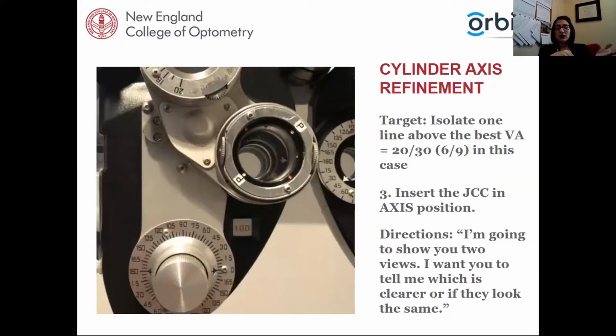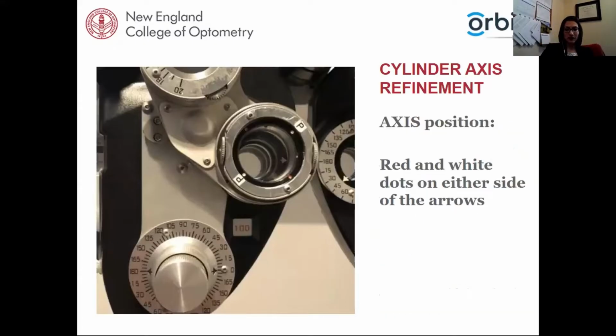You would then insert the JCC, so you rotate the JCC into place, it clicks in. And you want the JCC to be in axis position. And we'll talk in a moment about what the difference is between axis and power position. And the directions that you give the patient at this point are, I'm going to be showing you two different views of this one line. I want you to tell me if one looks better than the other, or if they look about the same. So that's my general instructions that I'll give to start, and then we'll see how it goes from there. You may get various responses from your patients, but that's generally how I start the directions for this step.